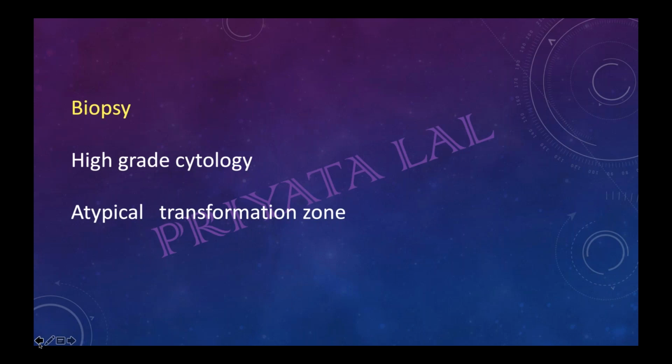In the beginning when I started the class, I explained what the colposcopy findings are, what the normal colposcopy findings are and what would be abnormal. If you are finding any abnormal finding in that particular transformation zone, that will be atypical, that is not the normal thing you will find.